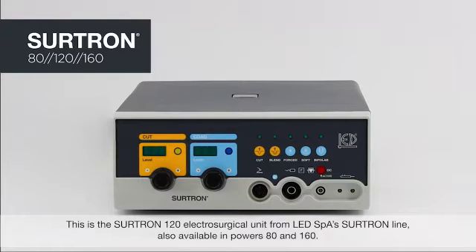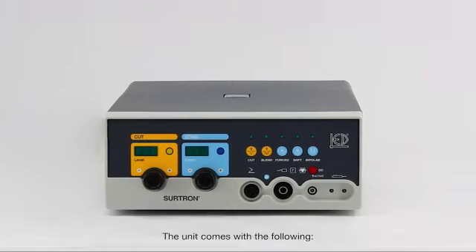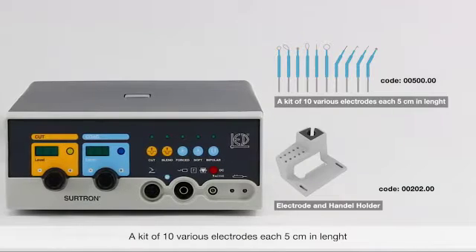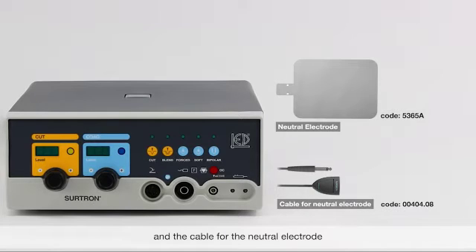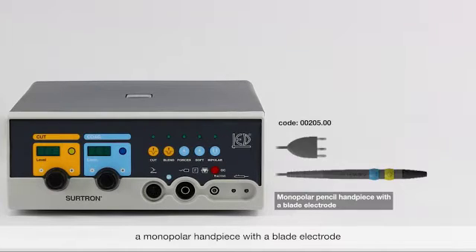This is the Surtron 120 Electro-Surgical Unit from LEDSPA Surtron Line, also available in powers 80 and 160. The unit comes with the following: a power supply cable, a kit of 10 various electrodes 5 cm each in length, an electrode and handle holder, a neutral electrode and the cable for the neutral electrode, a single petal waterproof foot switch, and a monopolar pencil handpiece with a blade electrode.